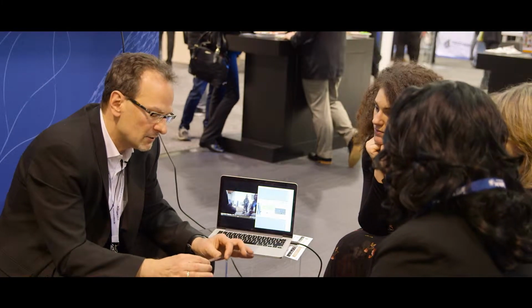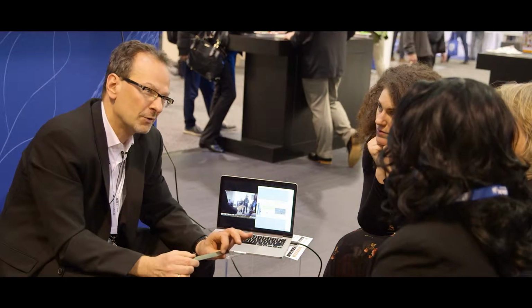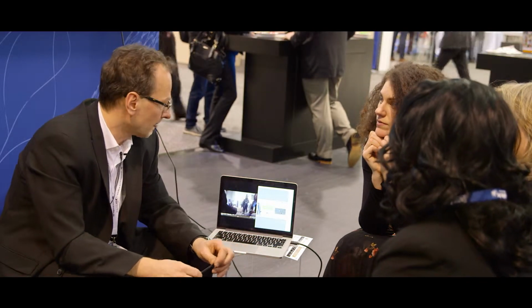So that's why you need to do a special surface treatment. For implants in Nitinol, typically all the implants today are electropolished. So you're putting a very, very dense titanium oxide surface layer on top of it to prevent that. That's very important. It's not necessary for single-use products or things which are very short in the body, but for long-term implants, you should do that, which adds a lot more complexity to it. But that's something that can be handled.